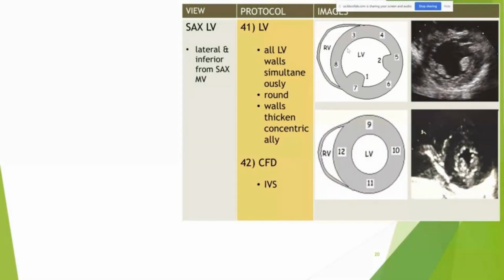Yes? Can I see that one more time, please? This is always going to be your anterior wall up here. This is your lateral wall, your inferior wall, and your septal wall. Follow? Yes. So I say late in September. Even now I have to remind myself. If this wall is dead completely, it means the lateral wall isn't working. If this wall is dead completely, it means the anterior wall is not working. If this wall is dead completely, it means the septal wall is not working.